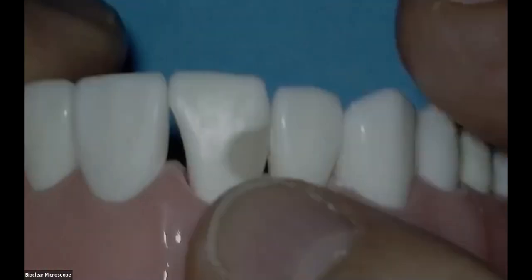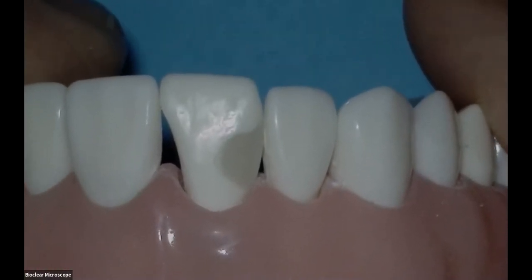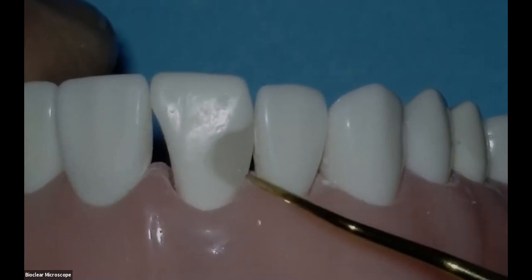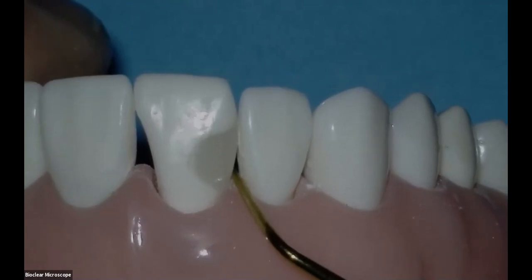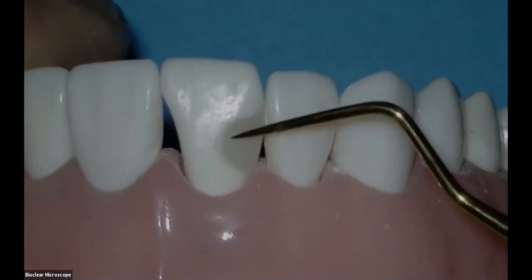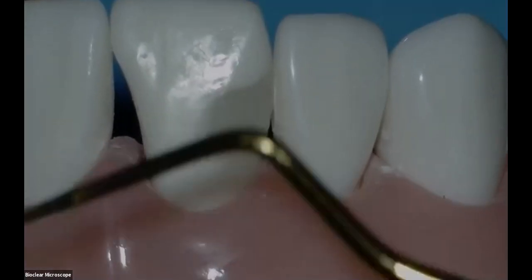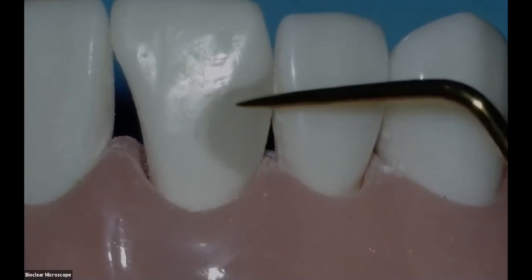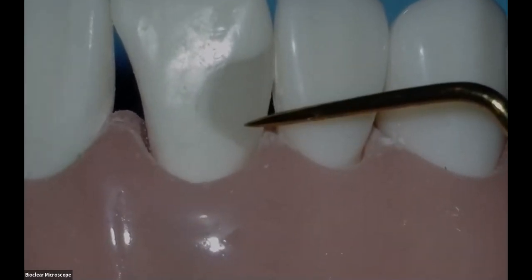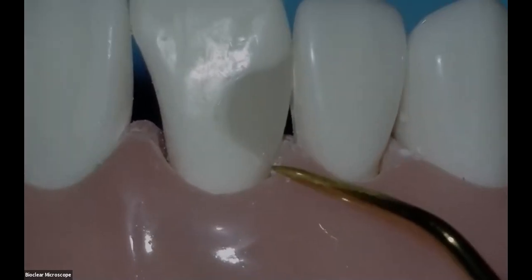All right, so let's take a look at some possible outcomes for this case. Now, this is not a very good outcome, okay? This was done with one of these new omnichromatic materials. It's very translucent. With the Bioclear method, we do not use translucent composites. If you take a look at this, this is a case where there was no radius bevel, there was no additive dentistry, but they just did a margin like the old days with these new omnichromatic materials.